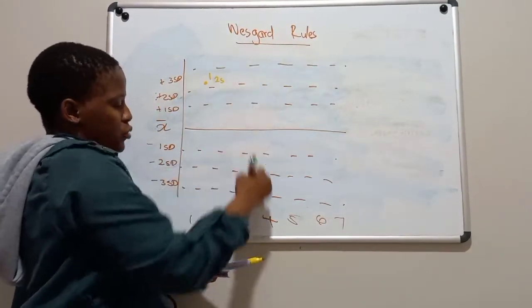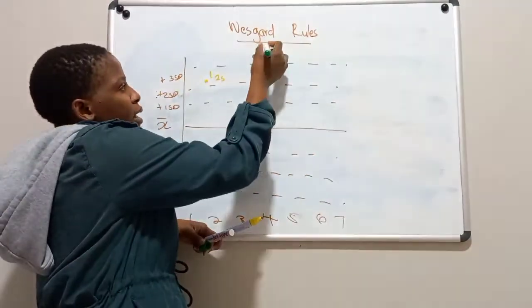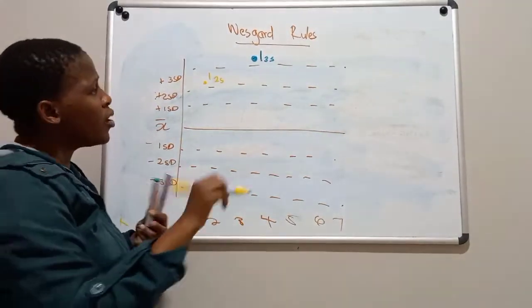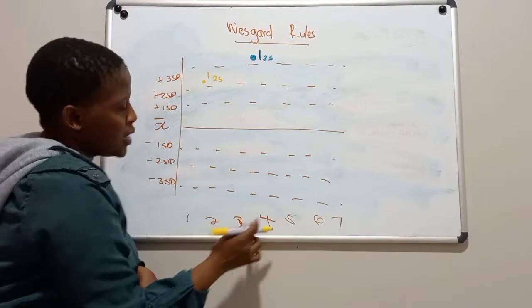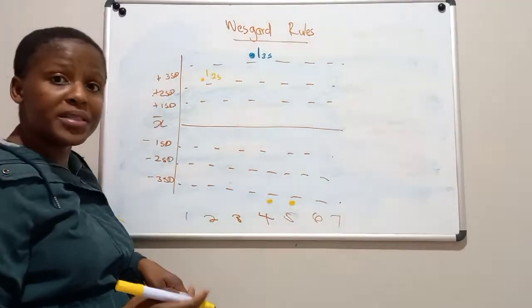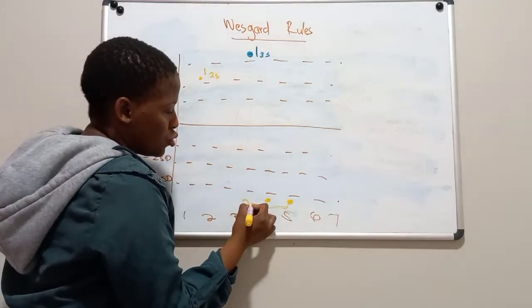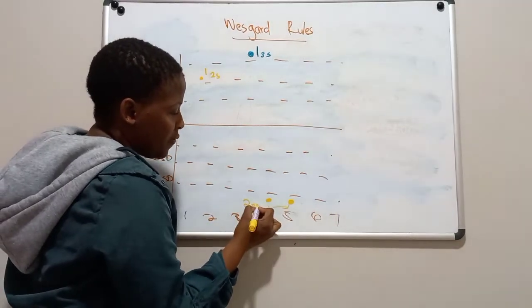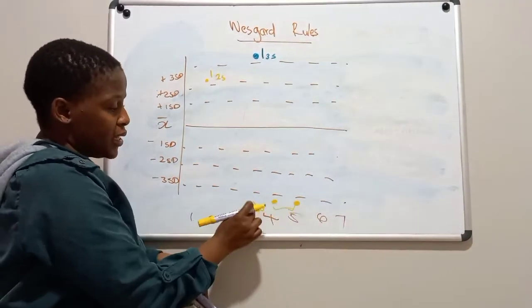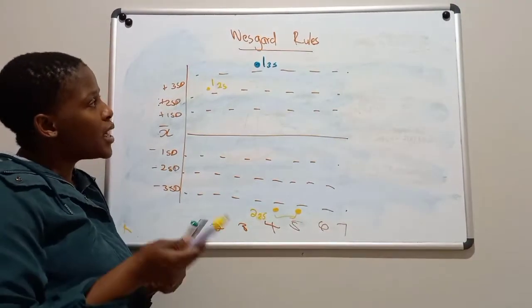So let's say on day number 3, you have a point there that is outside the 3SD. So this is the 1-3S. And then we also learned about the 2-2S. So on day 4, you have 2 consecutive points that are outside the 2SD. So it's the 2-2S. It means on your 4th and also your 5th day, your QC was outside 2SD. So you have 2 points, which is also a rejection.